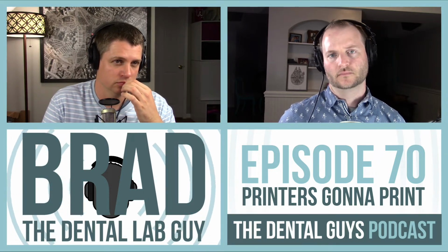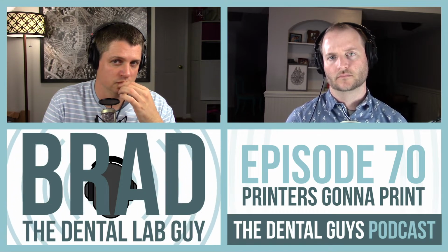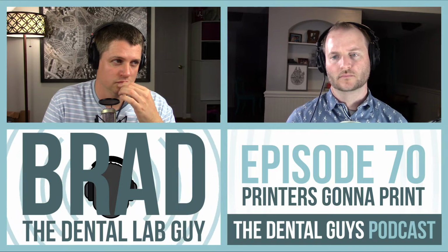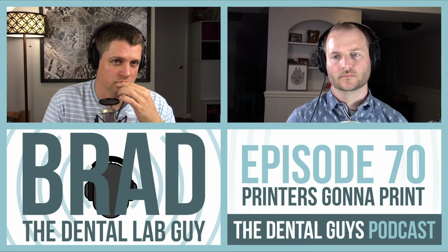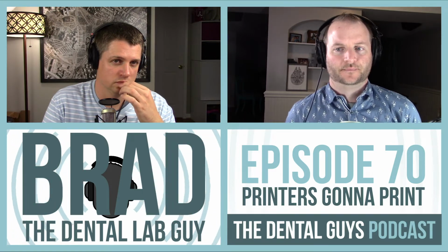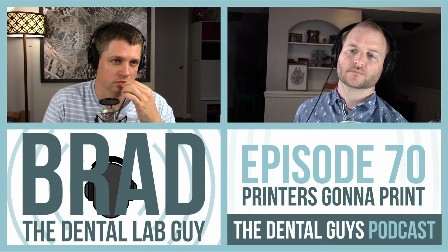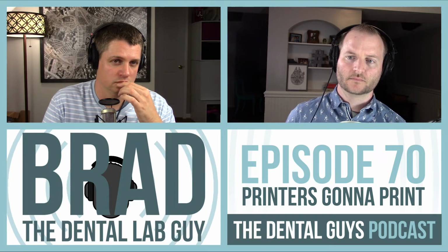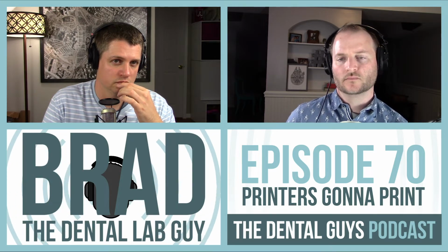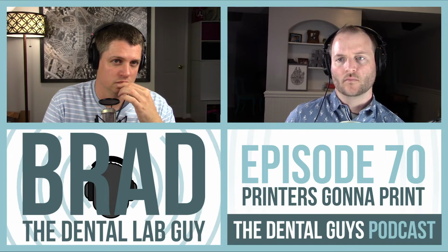So models are harder to make that work, depending on the technology, if you require that type of fit. If you don't, and you're saying, look, I'm just going to mill the crown and trust it's going to fit out of the CAD, I don't care if it fits the model, I'm only sending it for show, then almost any printer will work because you're just going to print a model. But if you want that crown to fit that model precisely, like a gypsum pour out of an impression, then it's a little harder to make that happen in a laboratory.